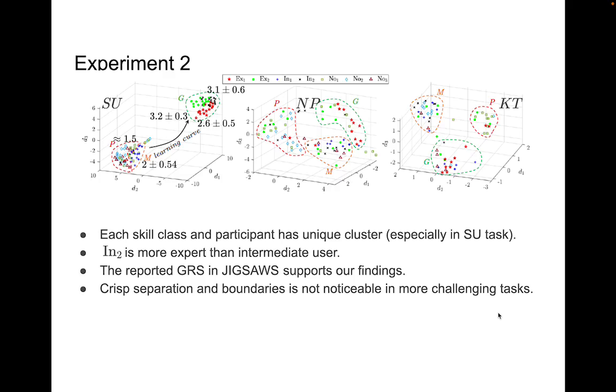As it is clear, trials of 2 expert users and 1 intermediate user, the second intermediate cluster in this figure, cluster close to each other and create the good cluster G, and each participant has their own subcluster. In fact, participants with a higher level of expertise perform each trial in a more consistent manner relative to less experienced ones. Such hidden information cannot be revealed by classification techniques or cannot be fully trusted in the data-driven models.